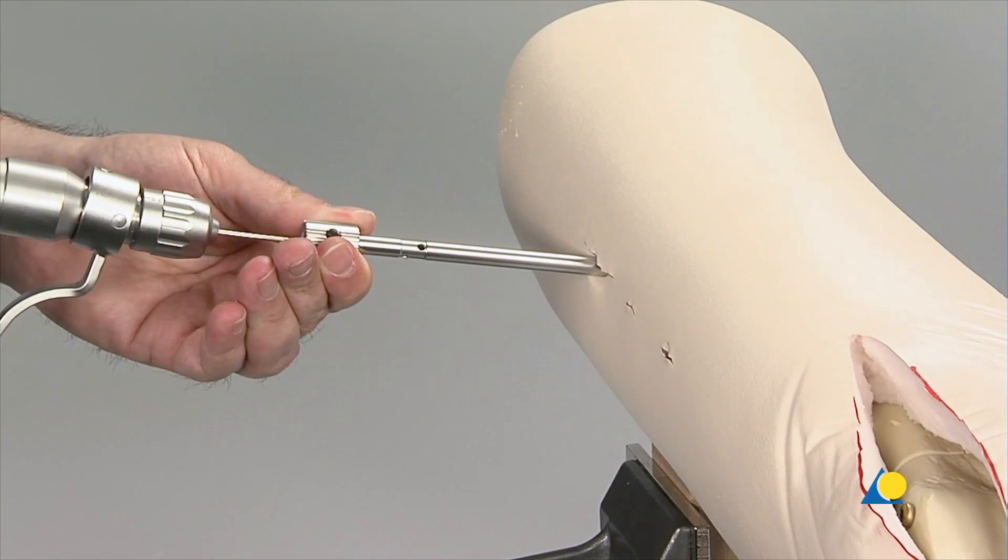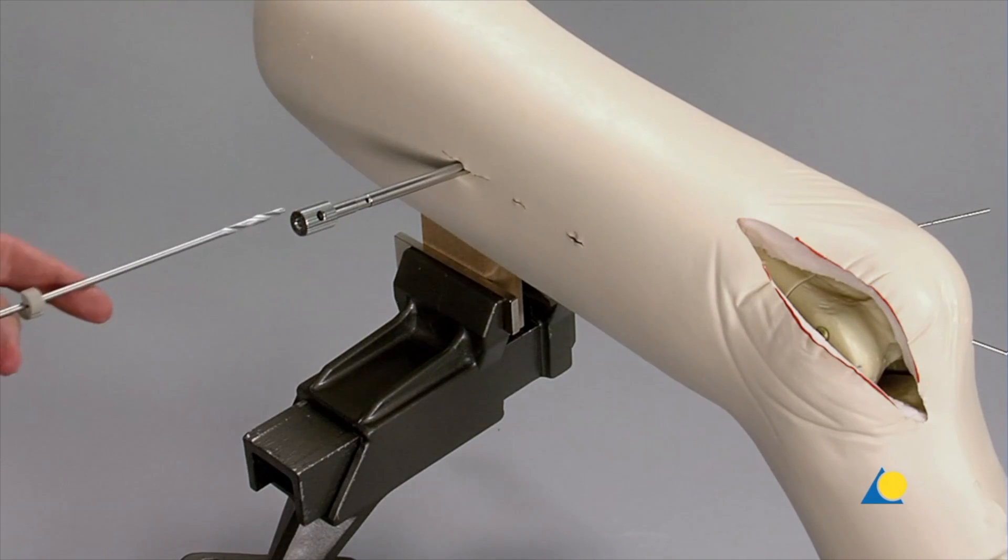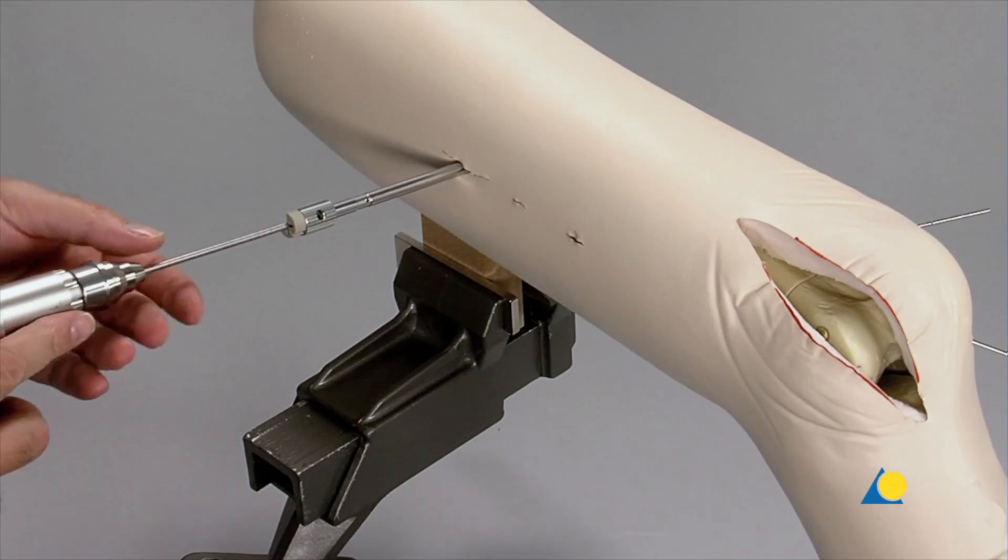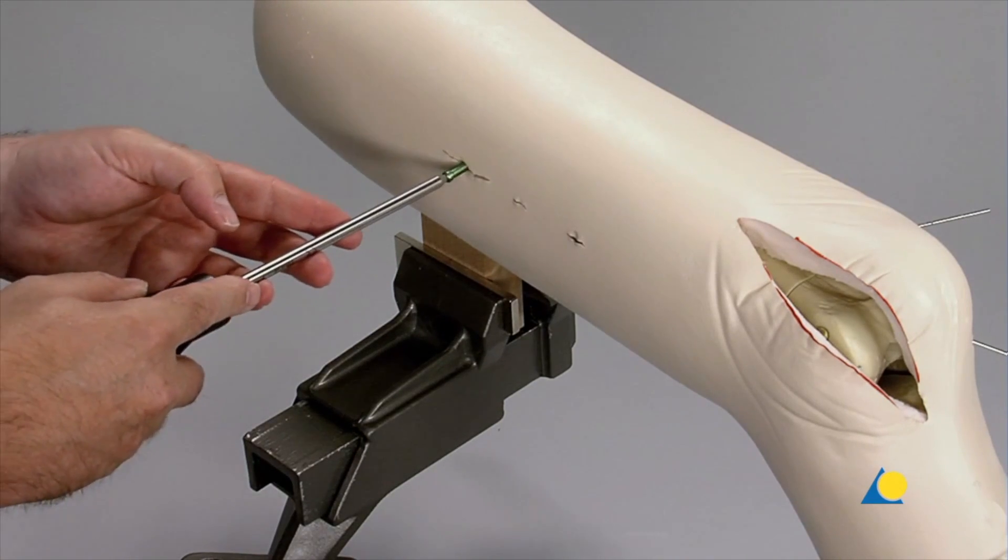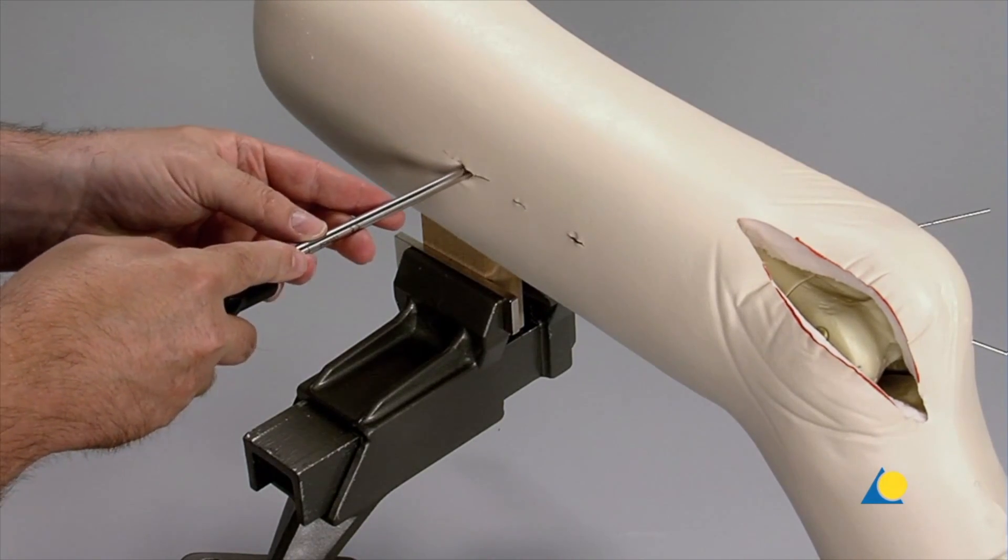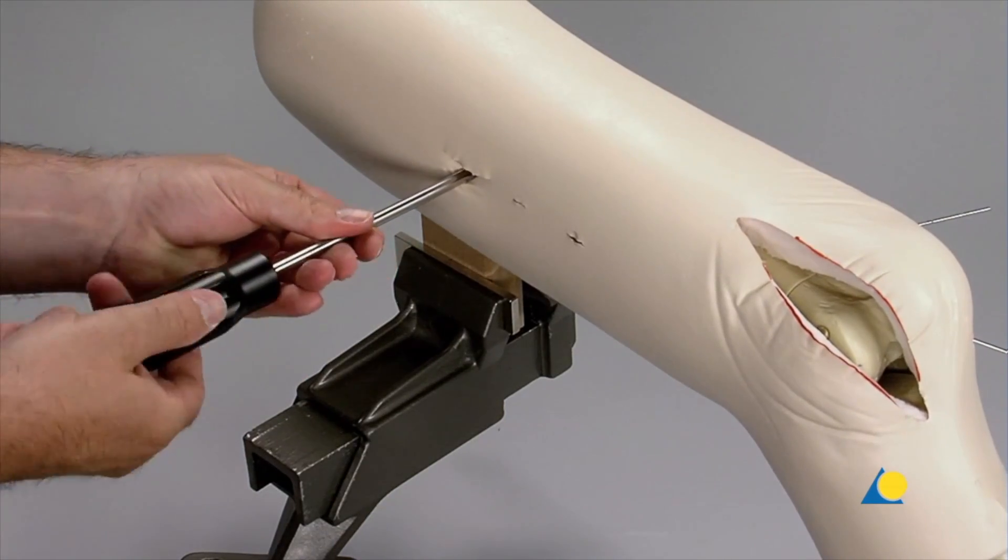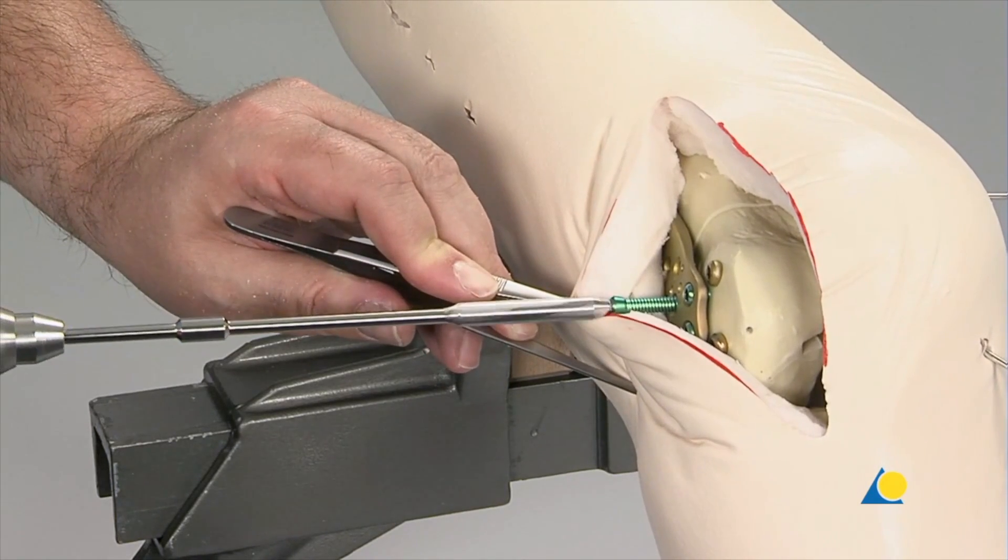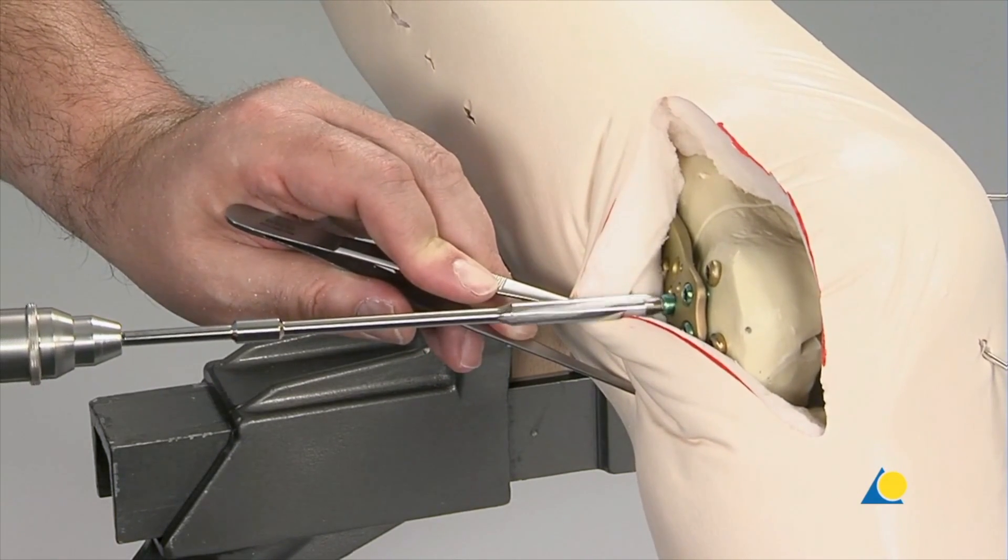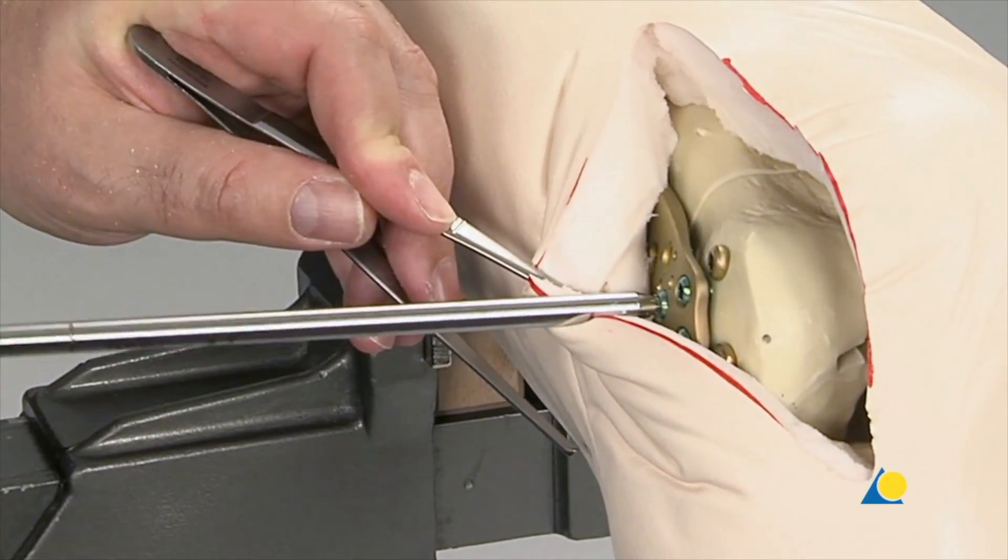The K wire is removed. The screw hole is prepared in the usual manner. The screw is inserted using the torque-limiting screwdriver. Distally, hole A is now filled with a locking screw, first under power. Then, final tightening is done with the torque-limiting screwdriver.